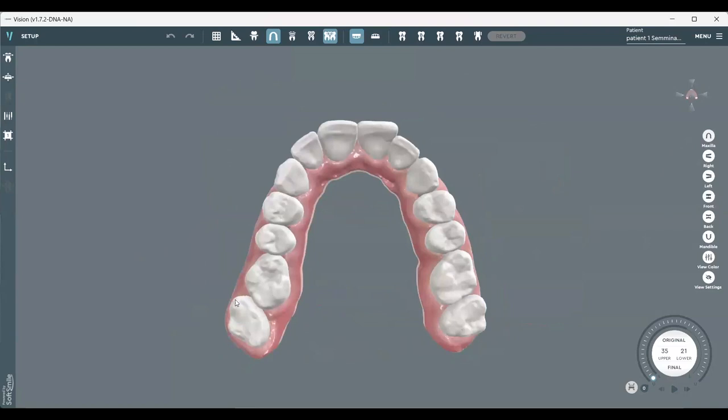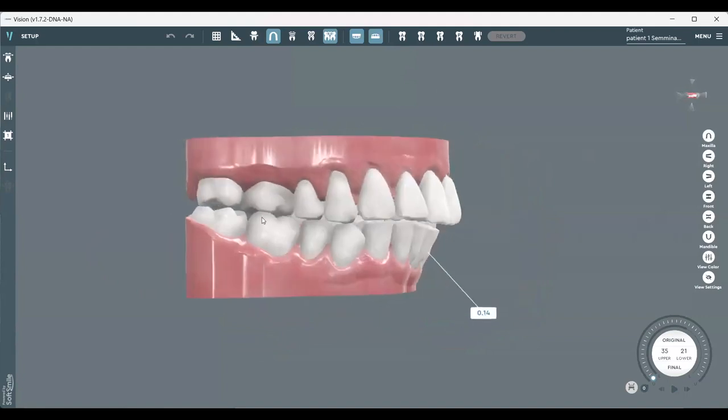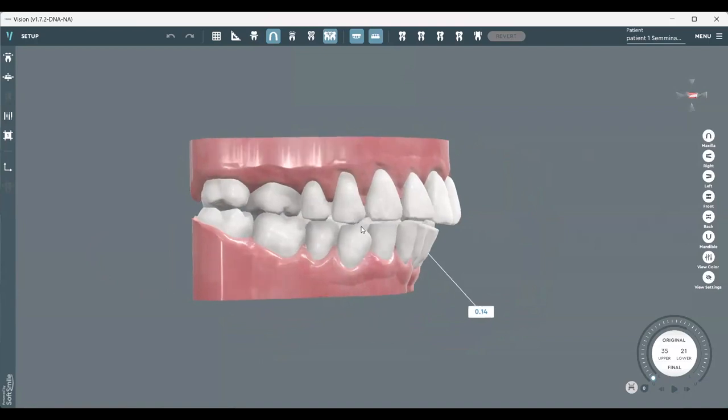Rotation of 6. This is going to open a space to do retraction. Always the derotation of 6 is going to open a space, especially here, because it's very rotated. When a molar is rotated, it needs more space, right? If we place it in correct position, we are going to win space. And we're for sure going to need distalization. You can see here, at least 3 millimeters of distalization. Here, with just rotation, we can achieve a good relationship because it's not too much distalization needed.